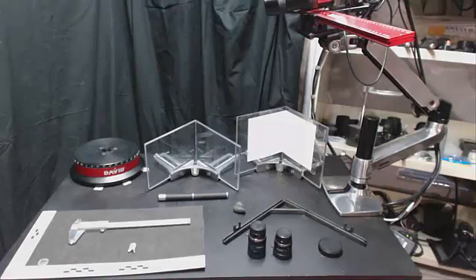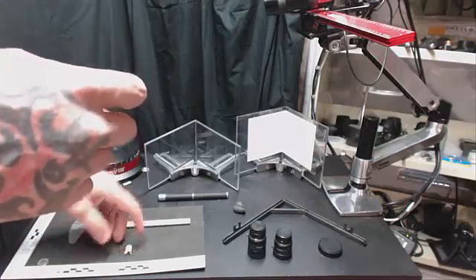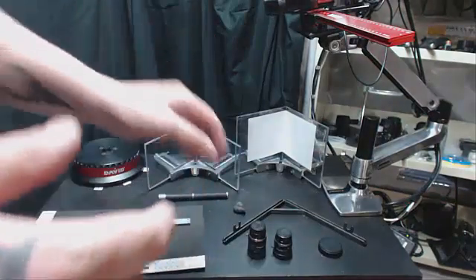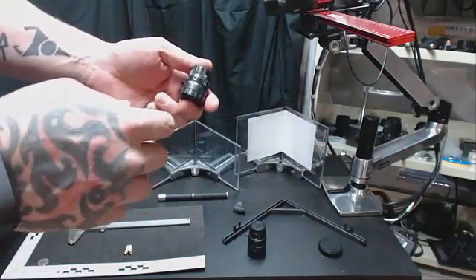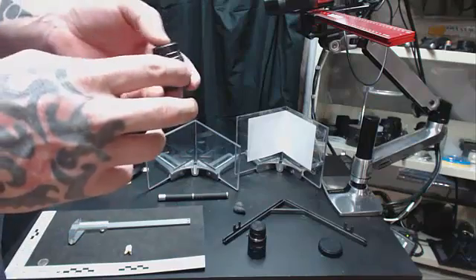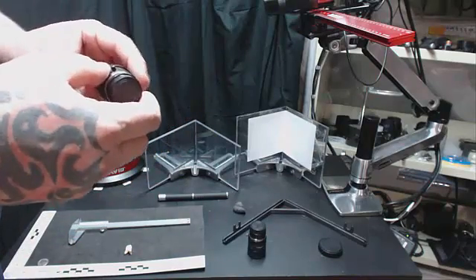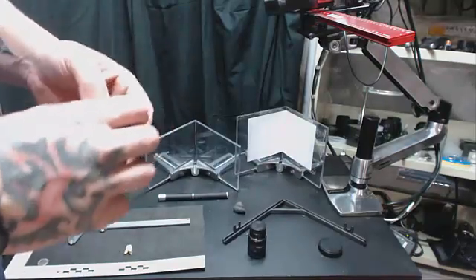The first thing you're going to need to do in order to do very small — approaching microscopic — imaging is you're going to need to get new lenses for your system. The 12mm CompuTar lens that comes with the David system is very good for general imaging, but it isn't going to allow you to get close enough to a small object to focus on it.